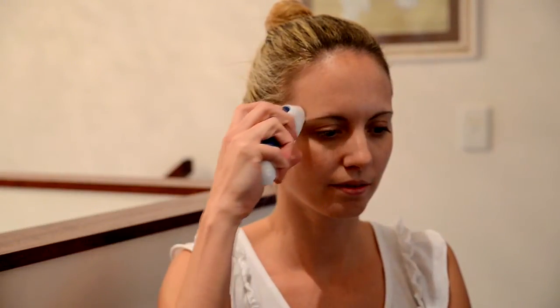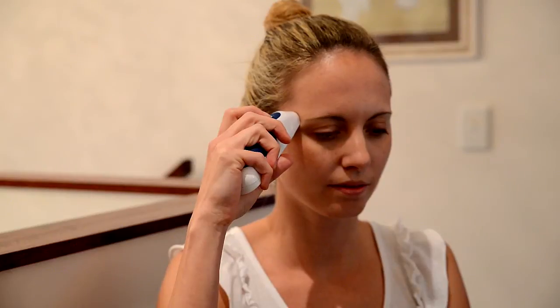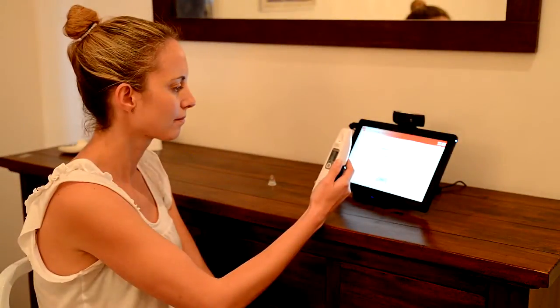Now, place the probe flat to your temple. Press and hold the scan button on the top of the thermometer and scan across the forehead to the opposite temple. Then release the scan button and remove the thermometer from your temple.